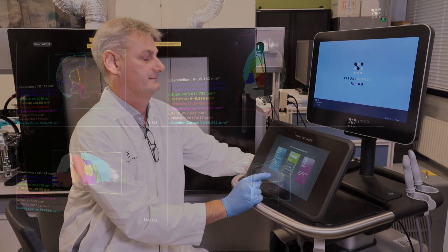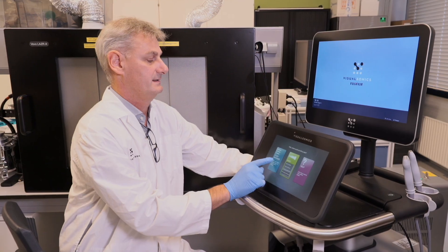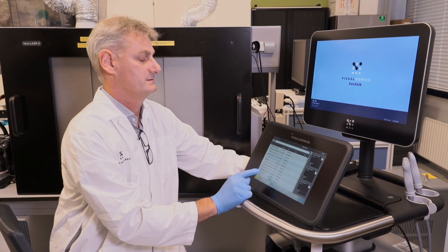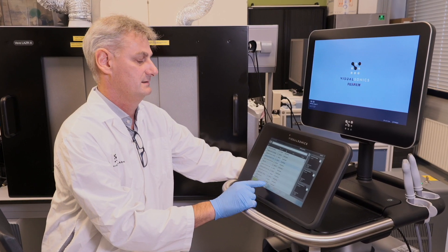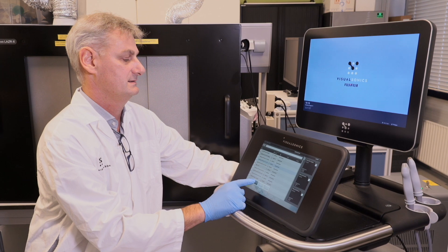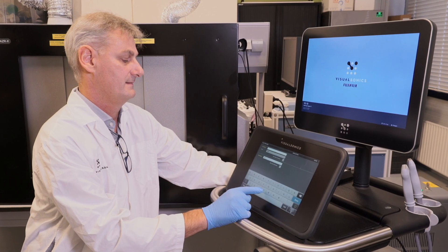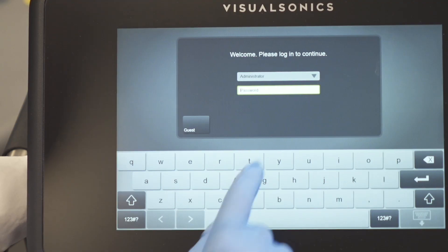The touchscreen user-friendly interface makes it very easy and intuitive to navigate through the system. It's just like using your smartphone.